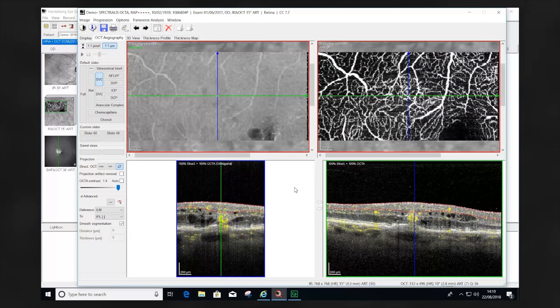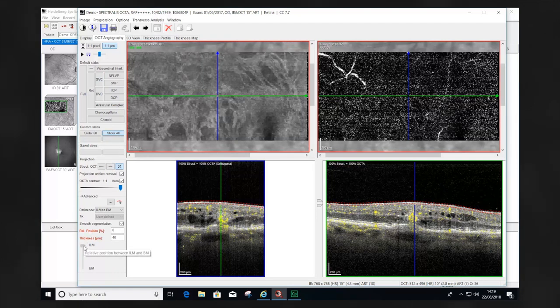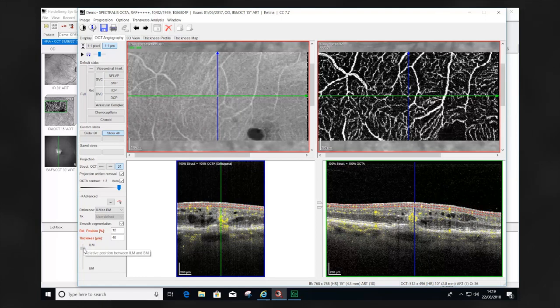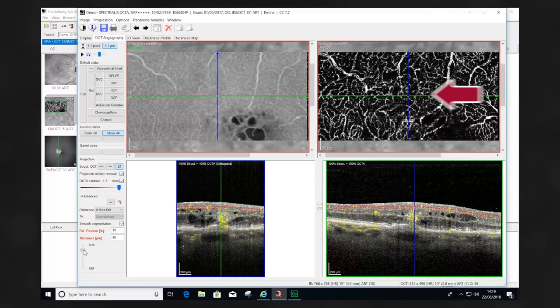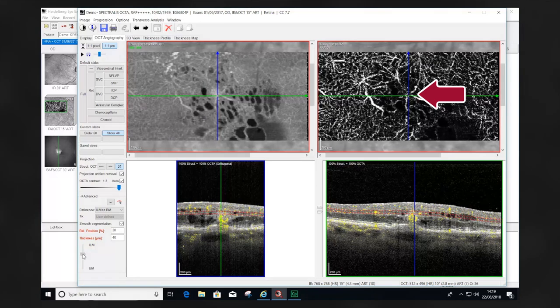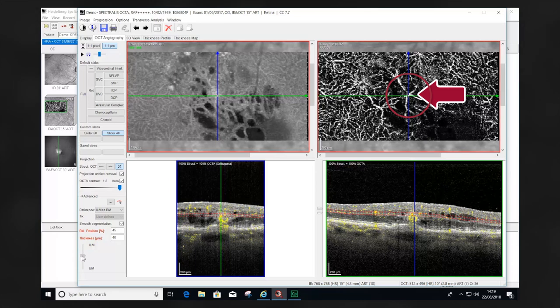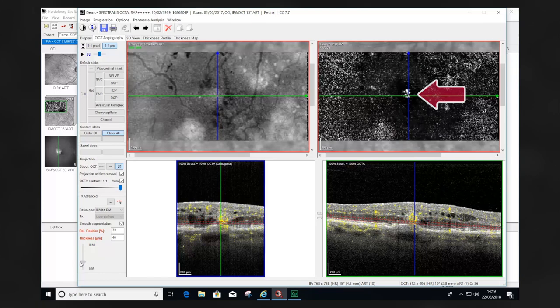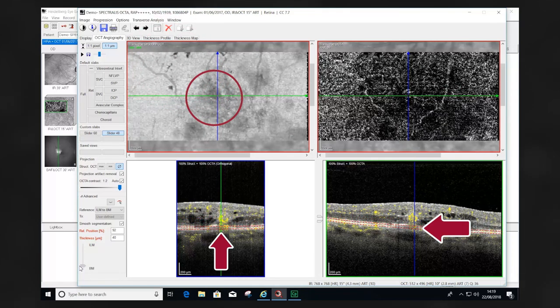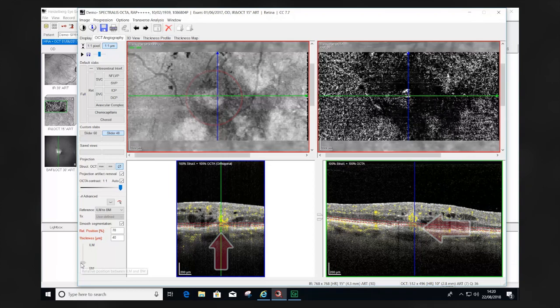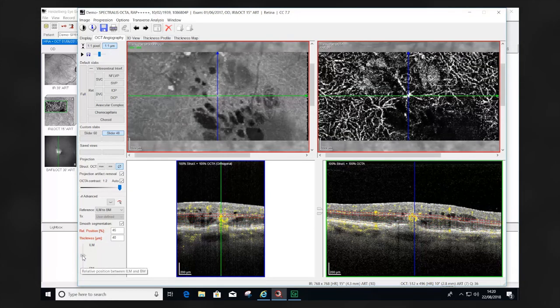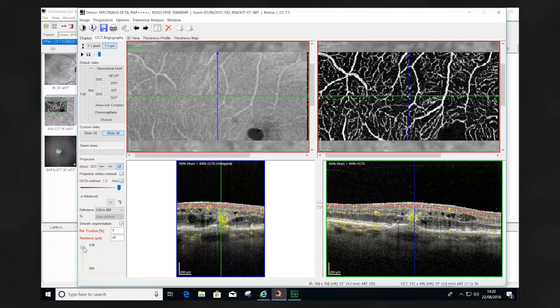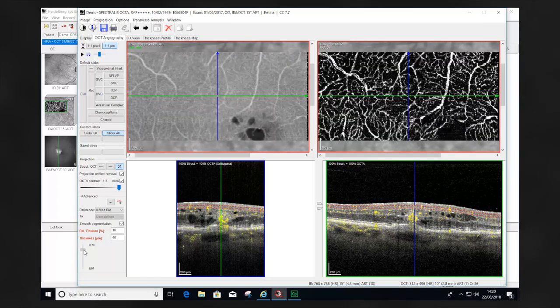This is a practical example of using the slider tool. As the segment is moved down through the retina, we can see in this example of retinal angiomatous proliferation, the RAP lesion is initially seen. As it's moved down further, we see the chorioretinal anastomosis and then later on the pigment epithelial detachment. It's important to also analyze the enface image as further information is gained from visualizing the exudate and therefore the nature of the process.